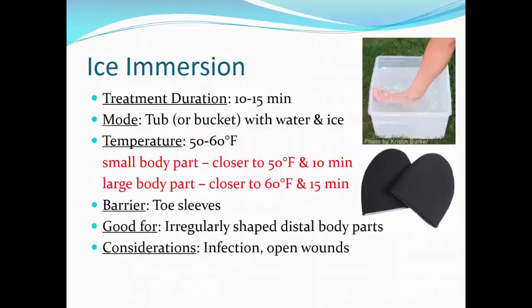An ice immersion is a tub or bucket that is filled with ice and water and is used for cooling large and/or irregularly shaped areas. The body part is usually the foot or the ankle, or the elbow, wrist, or hand. It becomes immersed in the solution. Ice immersion is the most uncomfortable of all cold treatments. Ice immersion, including cold whirlpools, is good to use with large areas, muscle soreness, or bony areas.